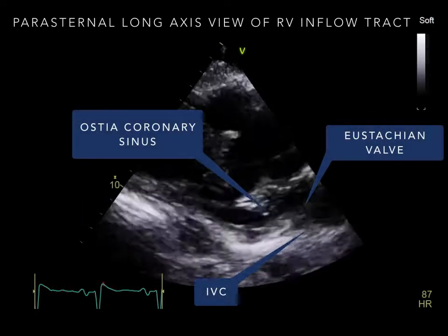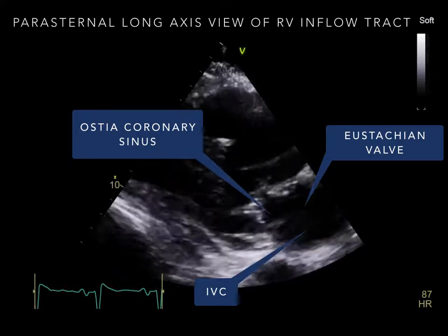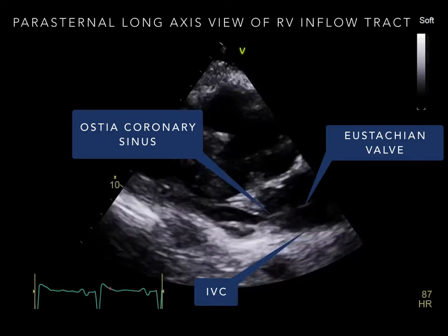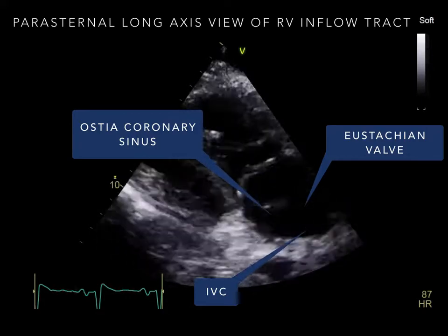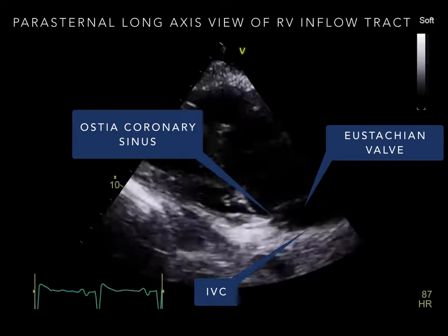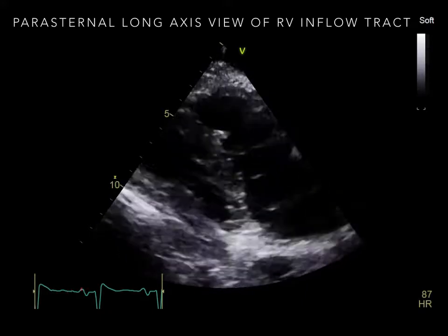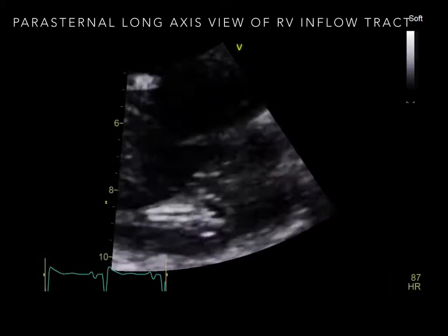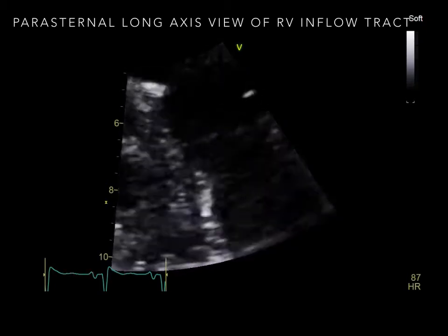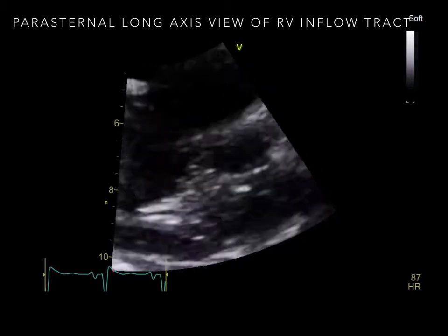The IVC draining into the right atrium is commonly seen. Occasionally, the coronary sinus can also be seen draining into the right atrium. A persistent Eustachian valve or IVC valve may be occasionally seen. In this zoomed-in image of the tricuspid valve, the leaflets should appear thin and they should be unrestricted in their motion.